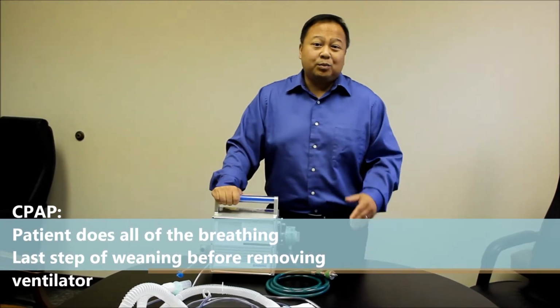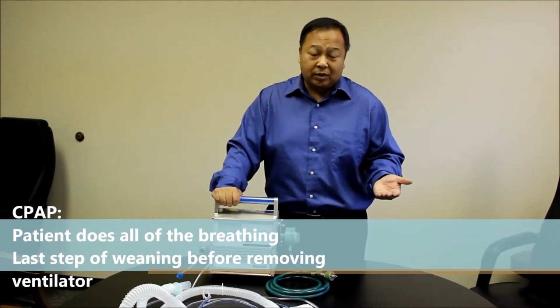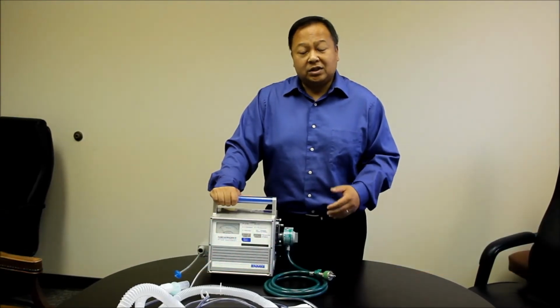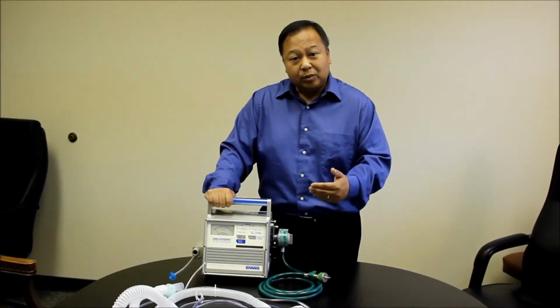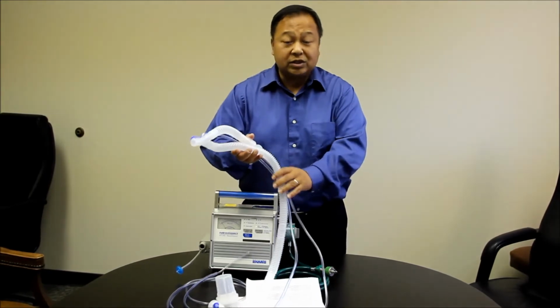CPAP is pretty much the patient being able to breathe on their own. Sometimes it's called pressure support mode or just pressure support breathing. But this is pretty much the patient doing all the breathing on their own. The support that we're providing is just so that the patient can compensate breathing through this tubing.